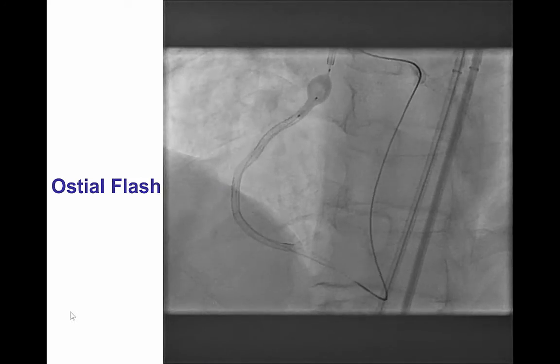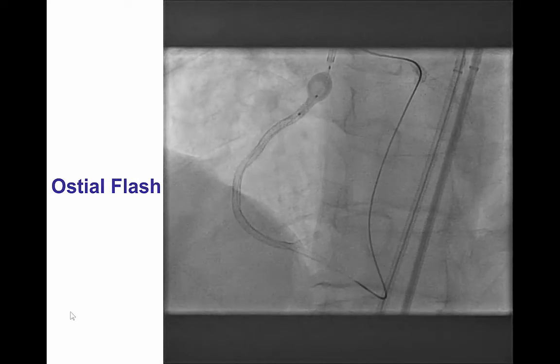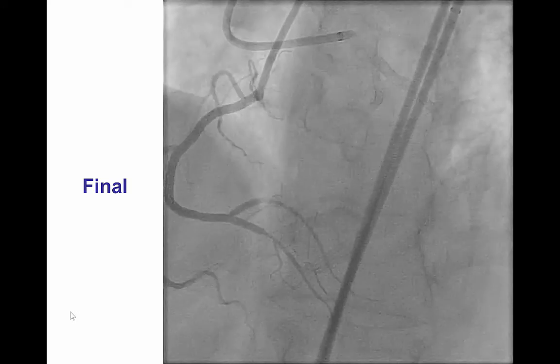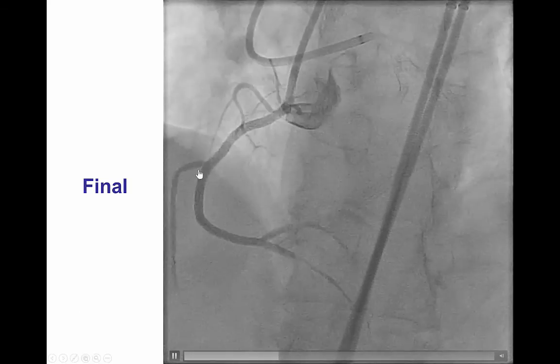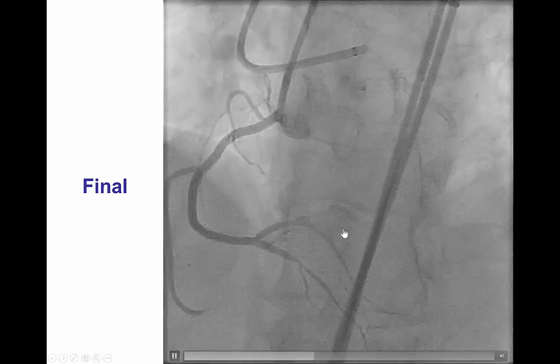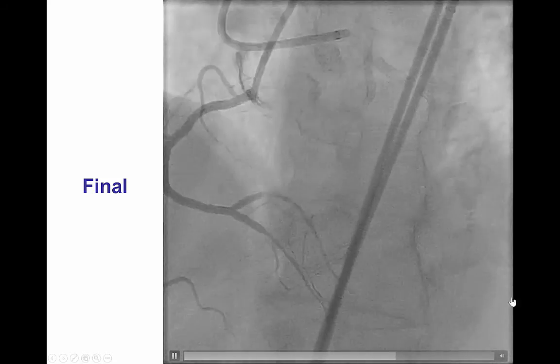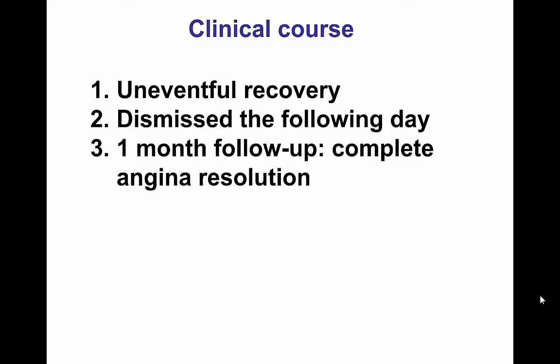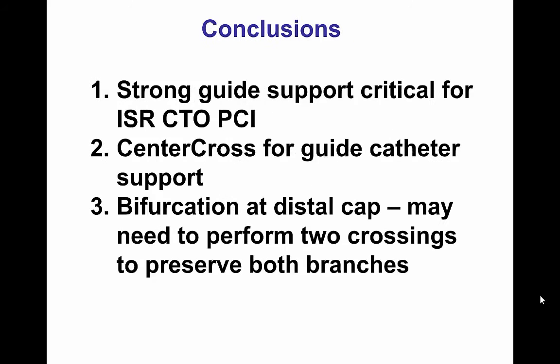This is the final result. After optimization of the proximal stent with an ostial flash balloon, we were able to achieve canalization of the occlusion with normal flow both in the PDA as well as the posterolateral branch. The patient had an uneventful recovery and complete angina resolution at one-month follow-up.